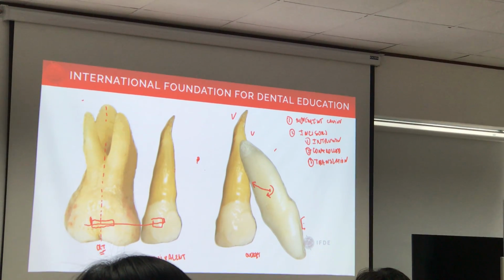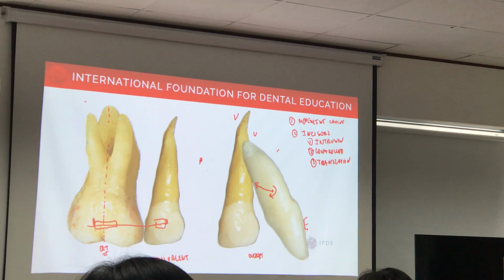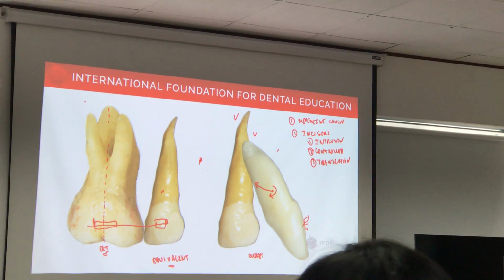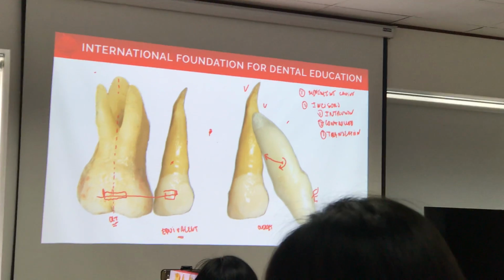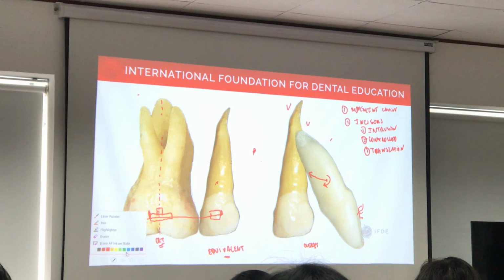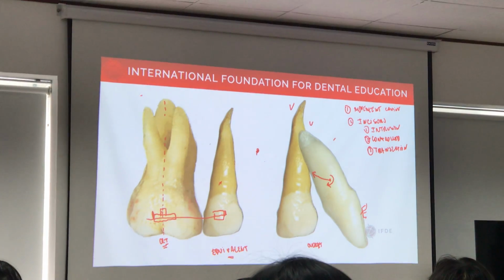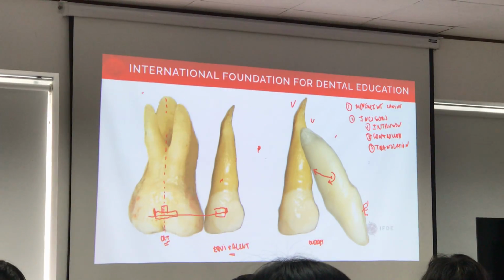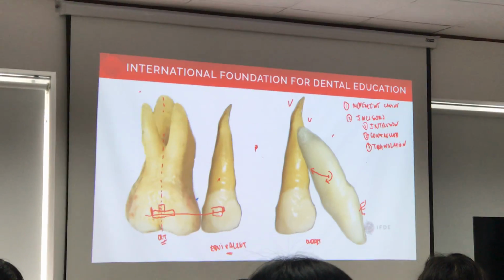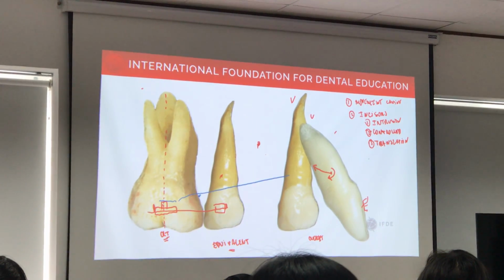Maybe you want to do a little... I don't know, it depends on the angulation, but you can put a little 2x4, and just a... Sorry, I'm trying to find what I have here. I'm going to change the color of the pen. And that's why I spent time on this, because I see so many issues with retraction and getting stuck after 7-8 months of treatment because you have not done it the correct way. So then you can even do a wire like this, and maybe a wire like this, something like this, okay?